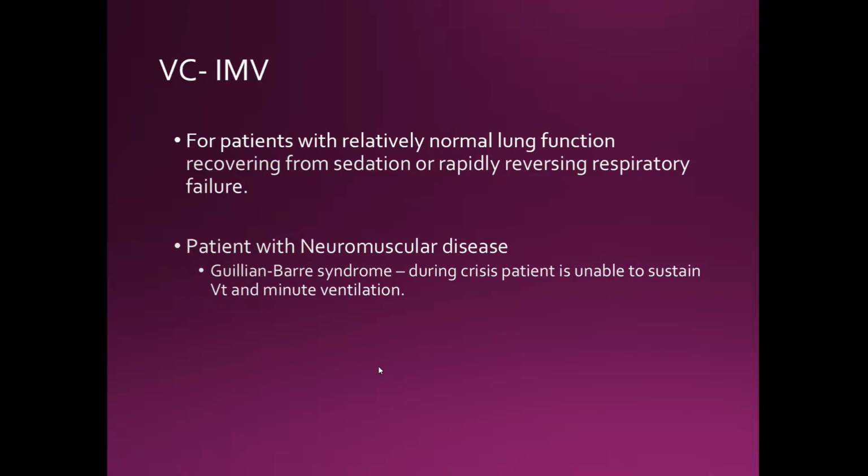We just control the ventilation, or we control the volume. And so we control volume, and that's going to depend on the machine giving the breath. It doesn't deal with the patient breathing their own breath. So if I have the patient on VC IMV, I have a set rate of 12, which gives me a total cycle time of 5. So 5 seconds per one breath.